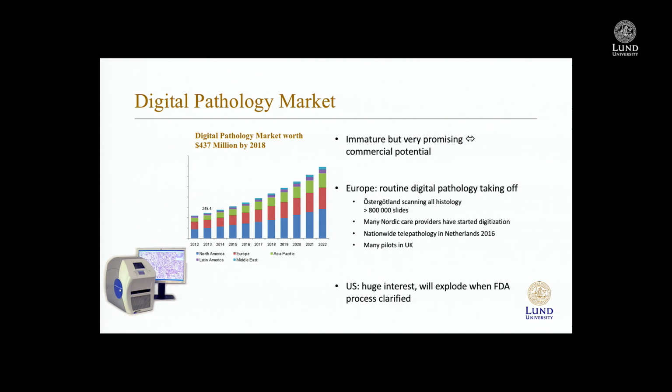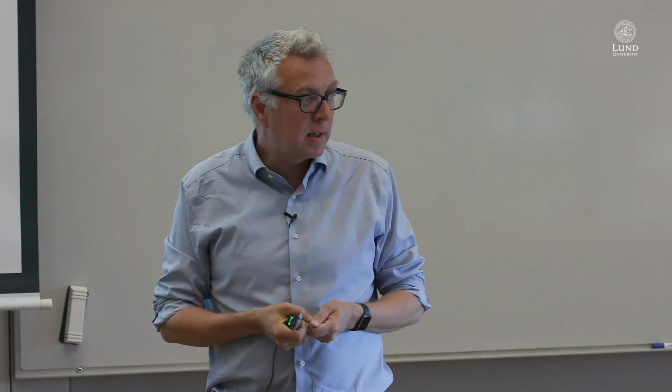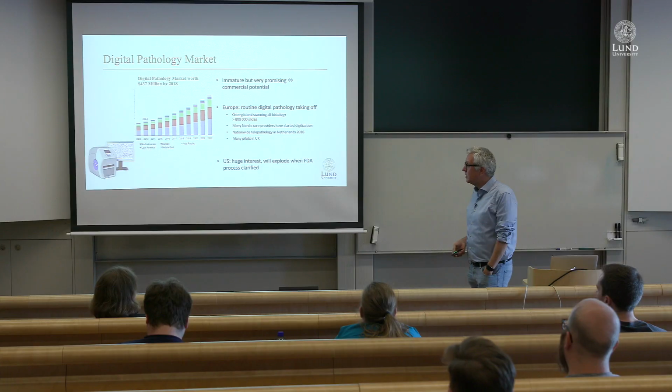Another reason why this is interesting right now is that if you compare to X-ray images, X-ray imaging has been digital for many years now, but pathology has been analog until now, basically. There are many reasons for that, but one reason is that these images are so huge. They are like 100 or 200 megapixel images. So the techniques and storing and so on have been difficult. But now we're at the point where it's becoming easier and easier.